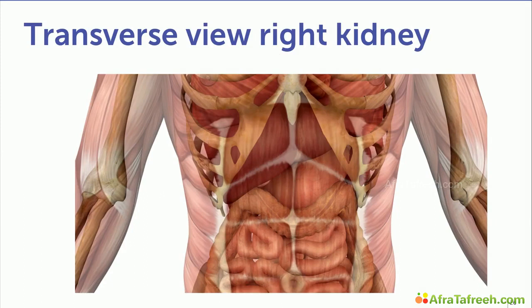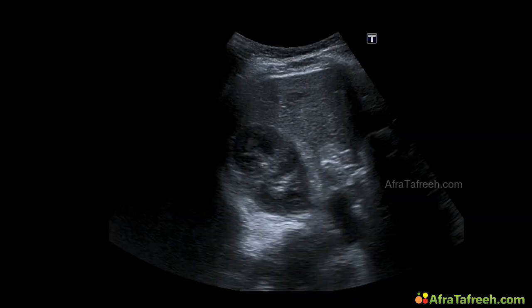The transverse view of the right kidney can be performed on both approaches. Subcostally and lateral-dorsally. In this picture, we got a transverse view of the right kidney.